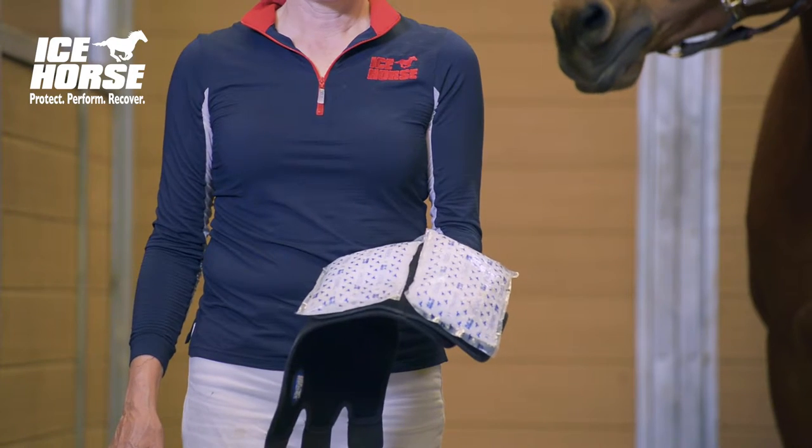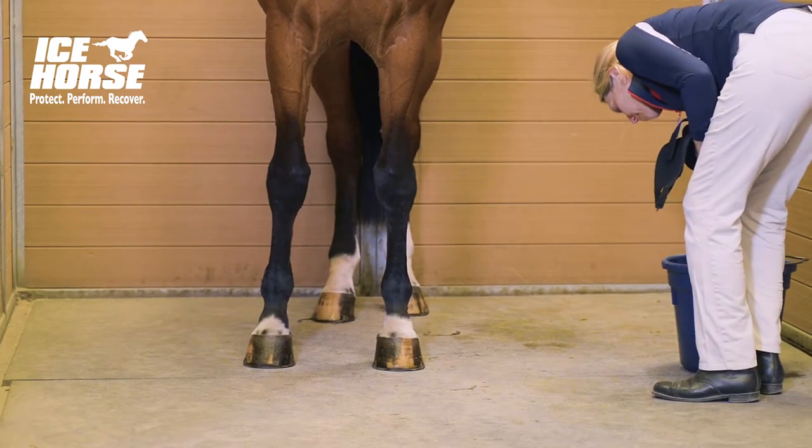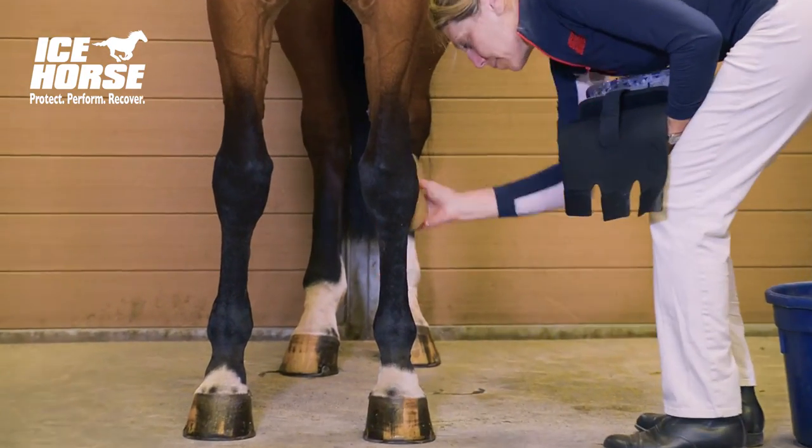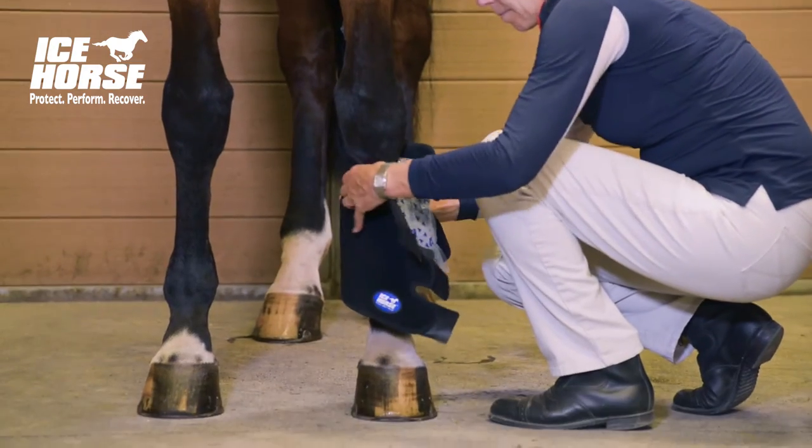Now you're ready to apply the tendon wrap to the horse. Lightly sponge the horse's leg. A thin layer of water will provide a better transfer of cold against the horse's tendon.